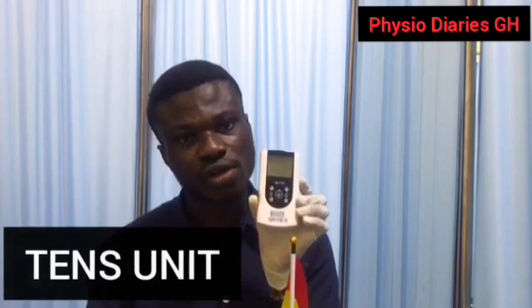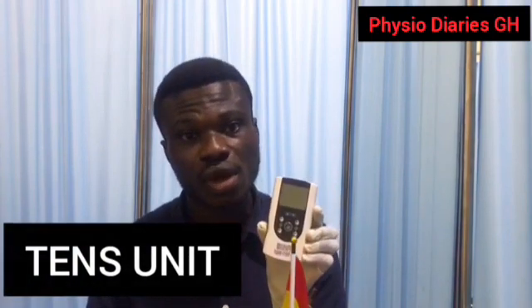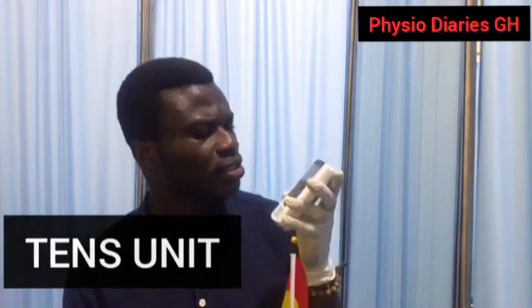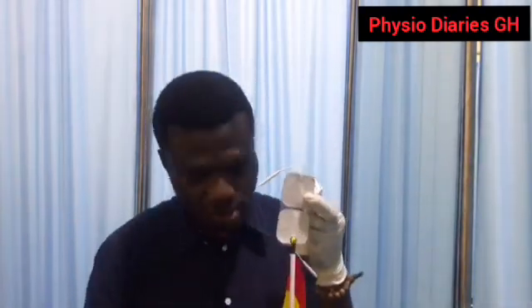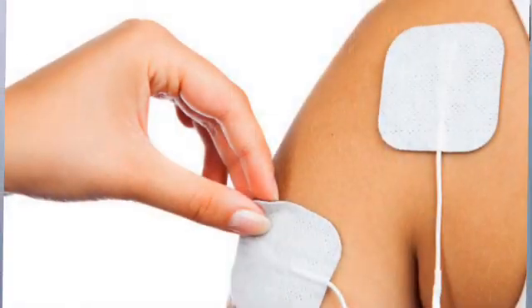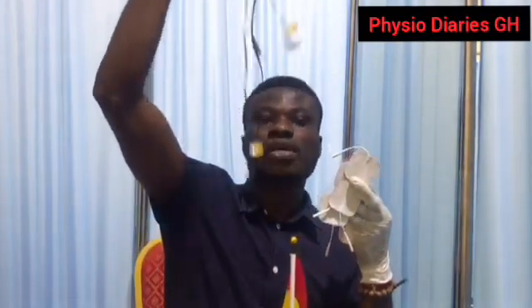So this is the TENS machine — Transcutaneous Electrical Nerve Stimulation. This is a small device; as you can see, it is very portable and can fit into your pocket. These are the electrodes, the materials that are placed on the skin, and these are the connecting wires.